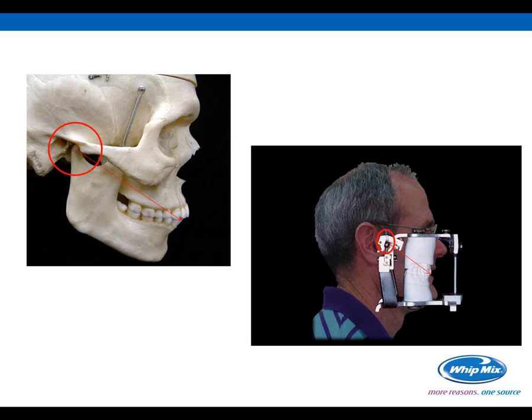So let me show you how this works. As I mentioned, the Facebow is going to capture the condylar position, or the hinge axis position, within about 5 millimeters. And we're also going to record the occlusal plane and then take this information and transfer it through mounted casts onto a semi-adjustable articulator. Now we can reproduce the patient's arc of closure and mandibular movement and come closer to harmonizing with the rest of the dentition and the rest of the teeth in the mouth.